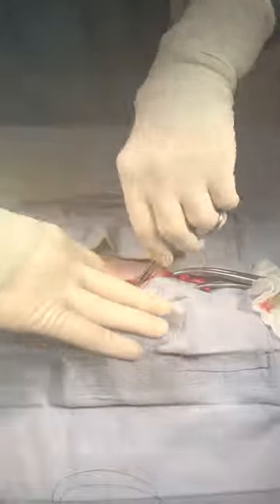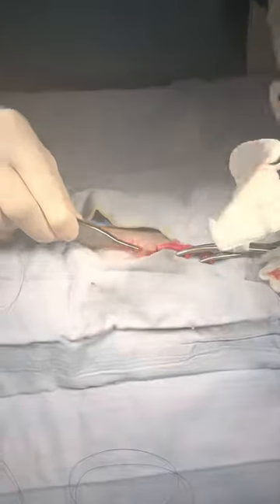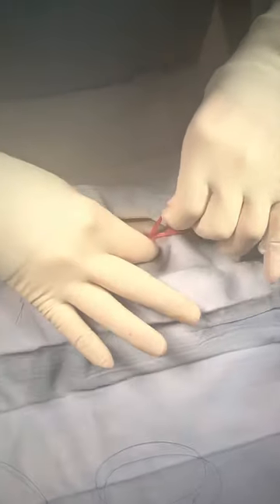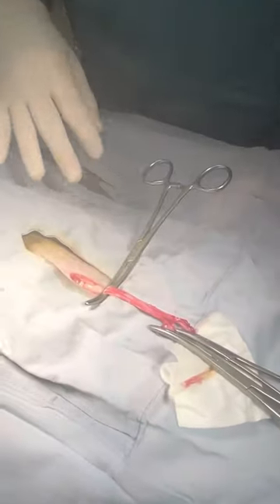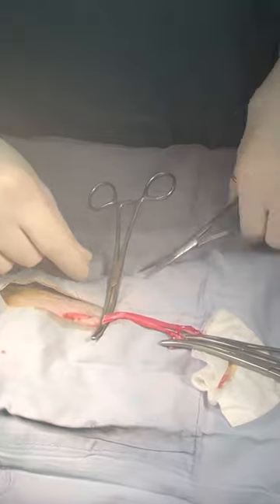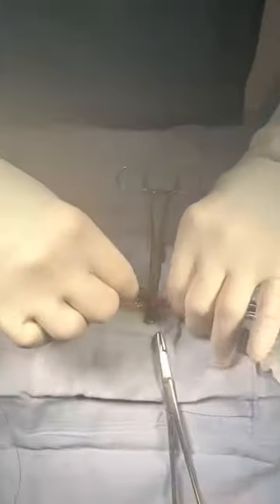Again, we put the pedicle back into the cat and then check for any bleeding — and there isn't any. Now we break down the broad ligament on the right side and then do the ligature just above the cervix, so that the entire uterus and ovaries of this cat are removed. She will never come into heat and will not be able to reproduce, which really is the goal with a pet cat, because they do not need to reproduce and they make much nicer pets when they've been spayed or neutered.